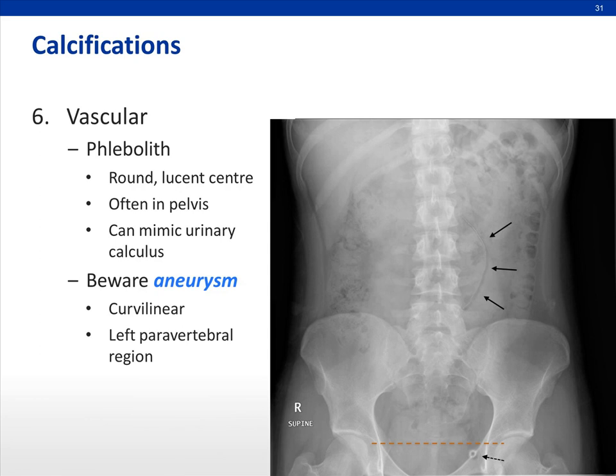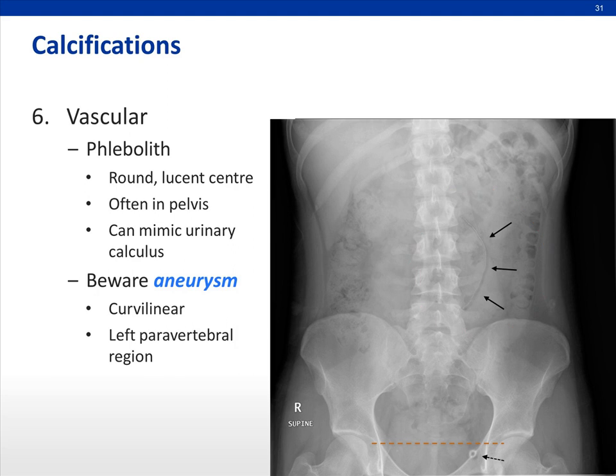Lastly, we do not want to miss an aneurysm. Always look to the left of the vertebral body for curvilinear calcifications, as shown here.